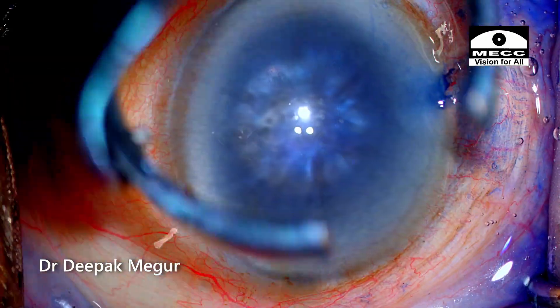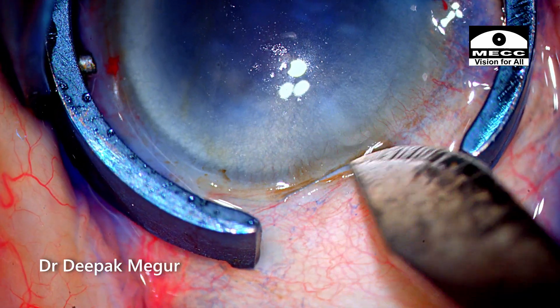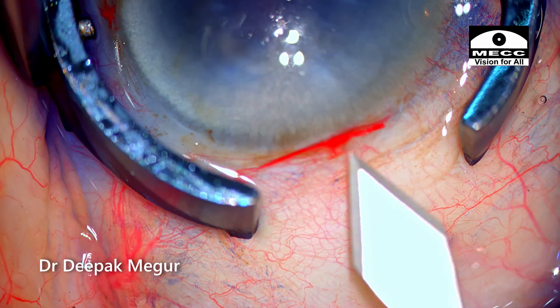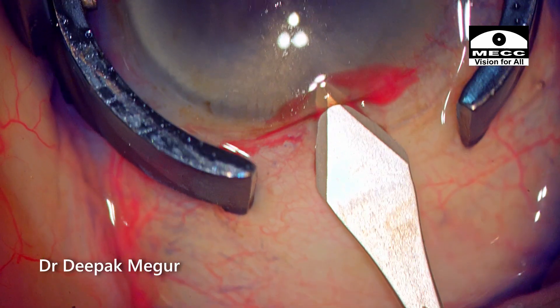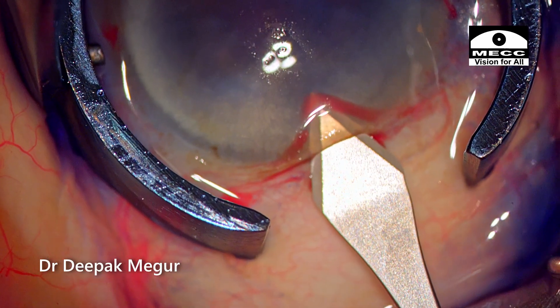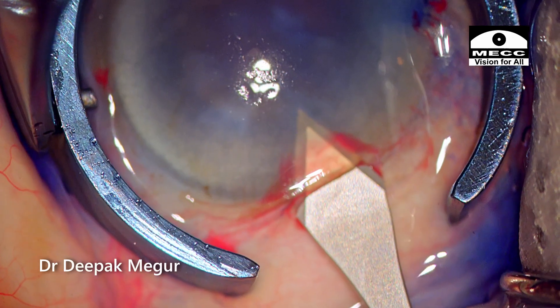I stabilize the globe and make my posterior limbal incision. As I am entering with my 2.8 mm keratome, I realize that the intracorneal tunnel is too long. Hence I retract a little bit and re-enter. This looks all right now.